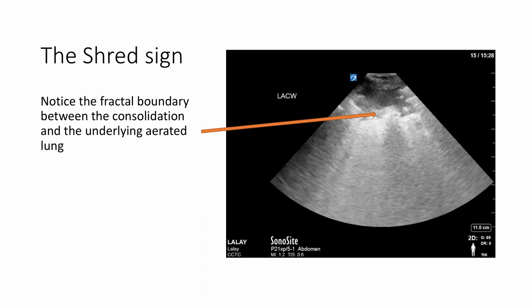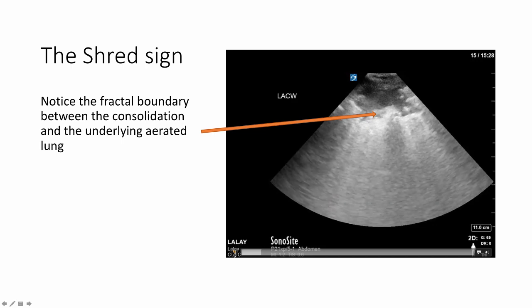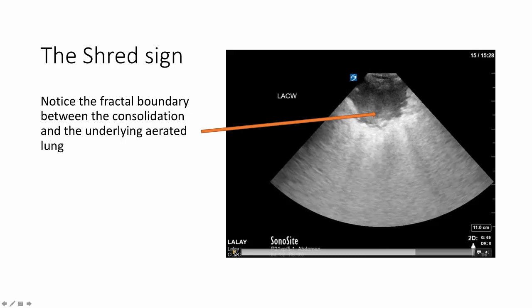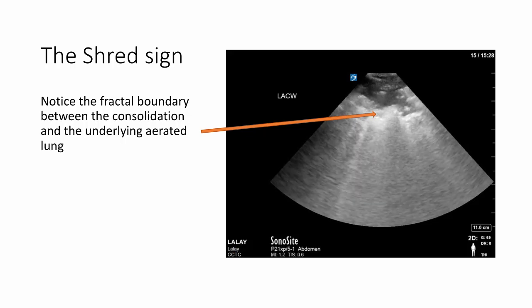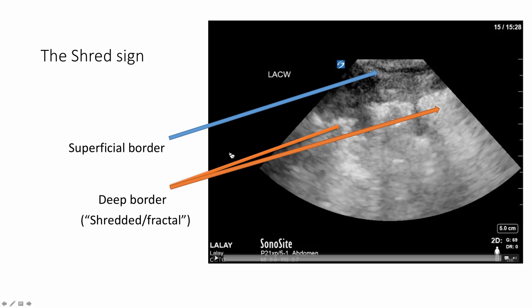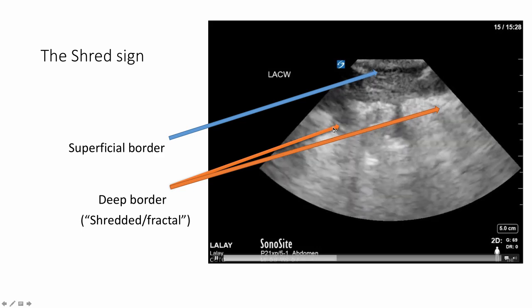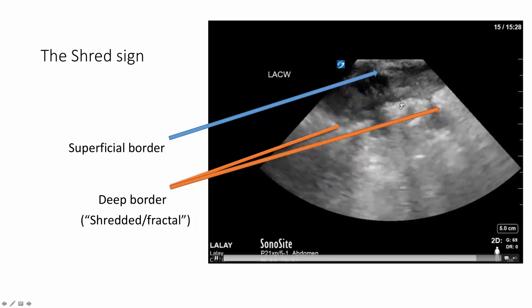Here's an example of the shred sign. We see a deep irregular border — a fractal or shredded border where we are at the boundary of aerated and consolidated lung. This image is taken from the left anterior chest wall position. The blue arrow points to what is considered the superficial border of the pleural line. The orange represents the deep shredded or fractal border. And this gives us the shred sign. Notice we have some B-lines emanating from this border.